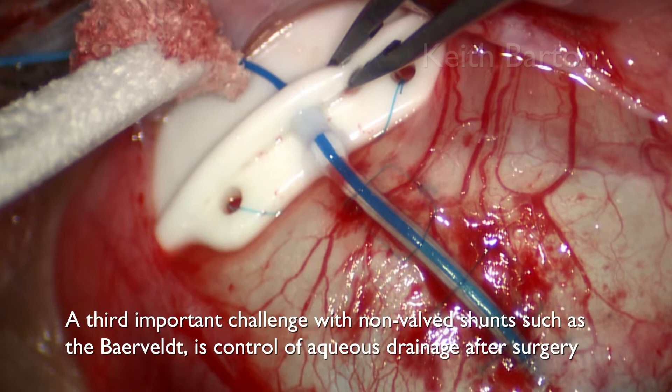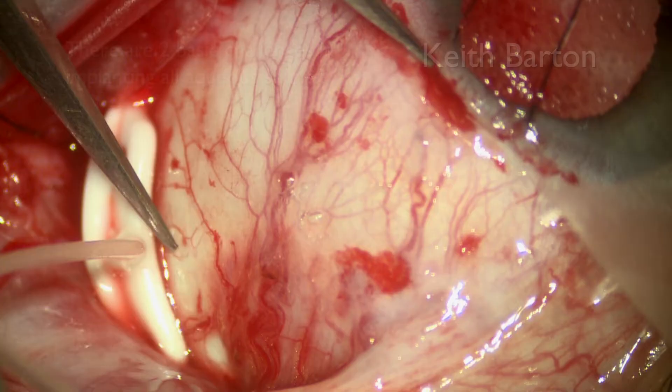A third important challenge with non-valve shunts such as the Baerveldt is control of aqueous drainage after surgery.